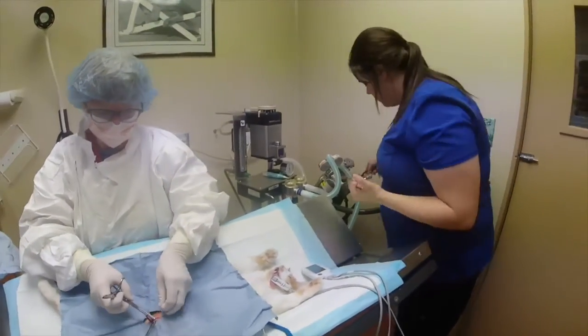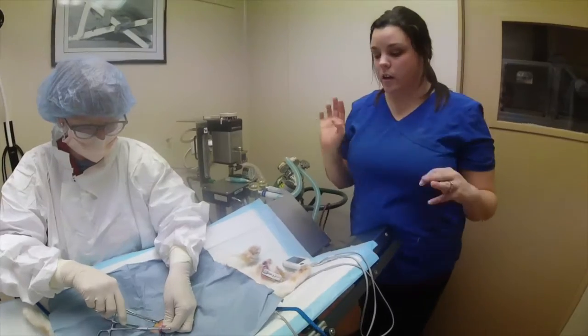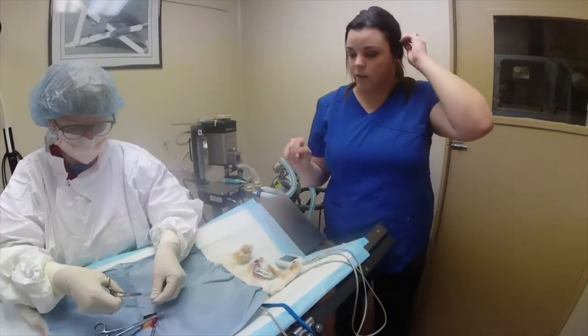Okay, we are good, and I will continue monitoring her temperature and the rest of her vital signs through her surgery.